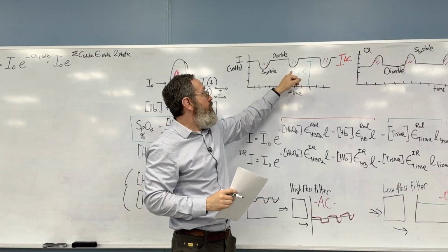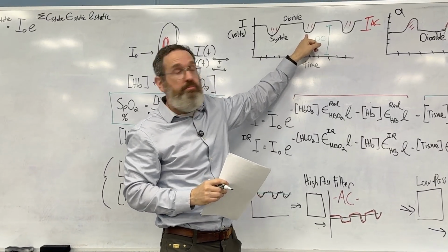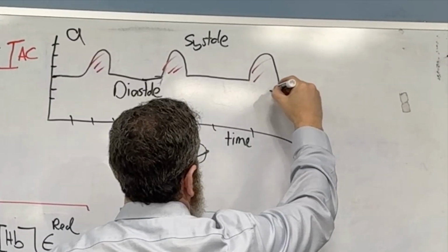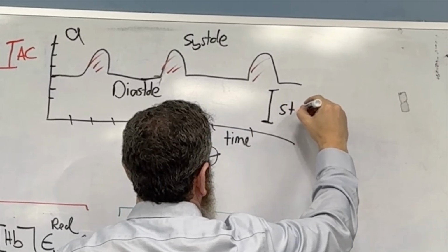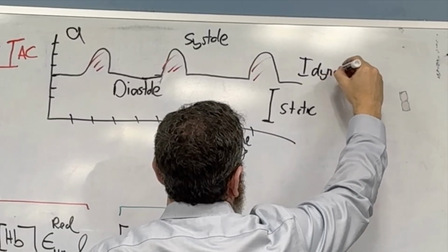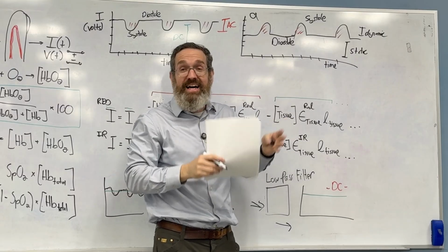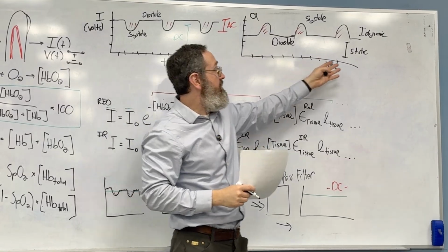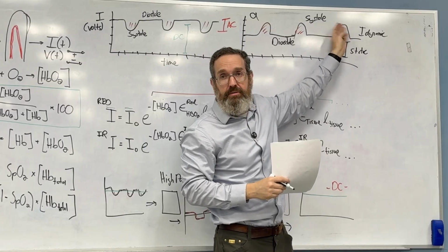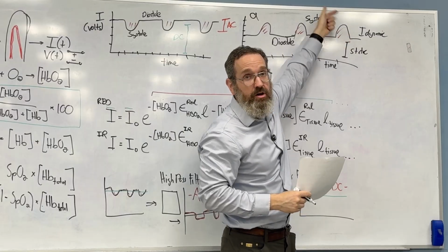Okay. Now, what's the equation for the amount of light I get through here? Well, it's going to be less, because let's look at it this way. Here is all the static, and then here I have the dynamic, right? So there's going to be less light when the heart beats, because everything that's there, fingernails and bones and sunscreen, is still there, plus blood, right? And to be clear, I should probably put this in the middle, because the dynamic is oscillating around it, okay?